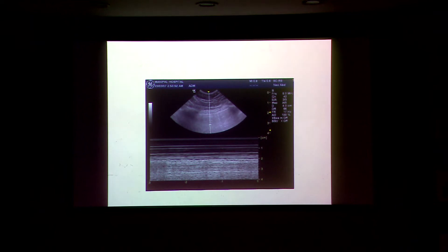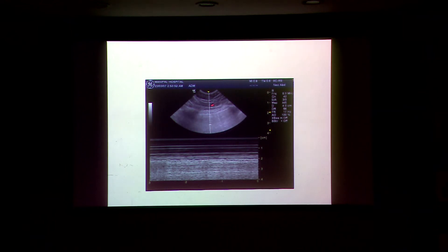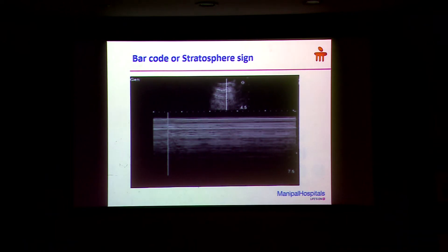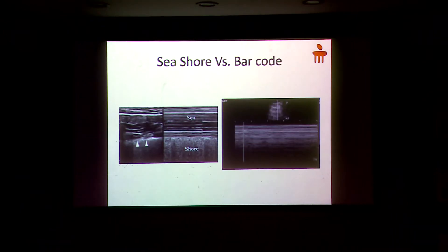The next assessment is done on M-mode. You put the probe in the intercostal space and do M-mode. Normally what you will see is called the seashore sign. This is the pleura; this is the skin and subcutaneous tissue; and this is the lung — it will look like the sea and the shore. This is a normal finding meaning the patient does not have pneumothorax. If the patient has pneumothorax, the whole image will look like the sea only — no shore at all. This is called the barcode sign.